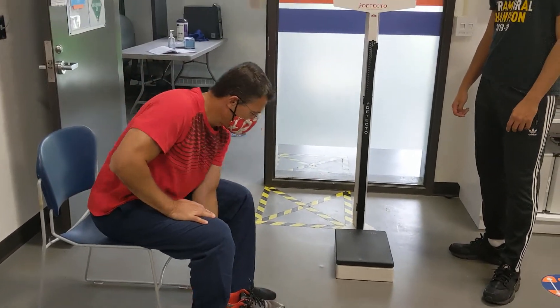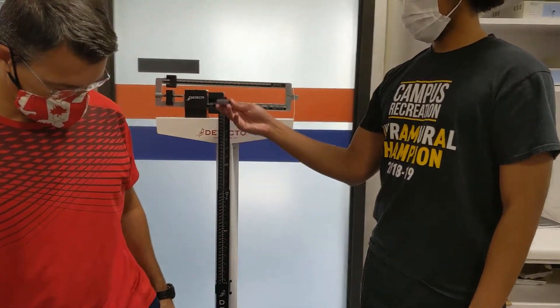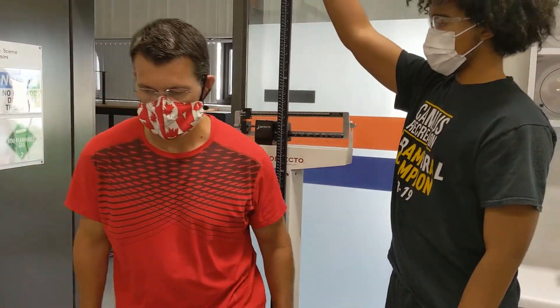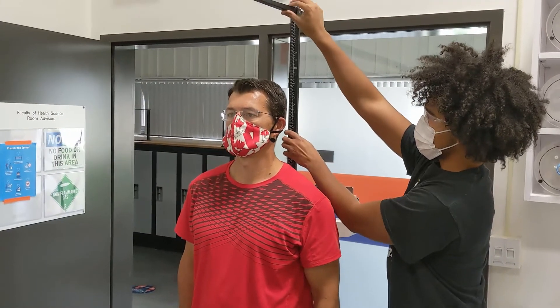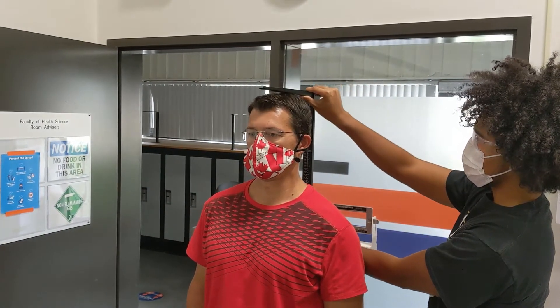Then, while the participant is stepping onto the scale, you want to flip the perpendicular portion out while sliding the vertical portion up much taller than the participant's height. Slide the vertical portion back down while having the participant stand up straight, and you can instruct them on how to do this.